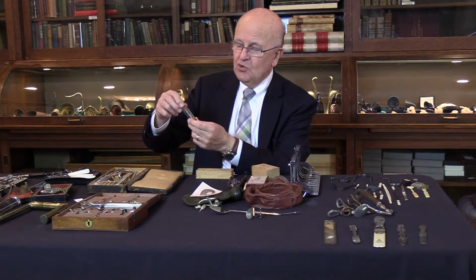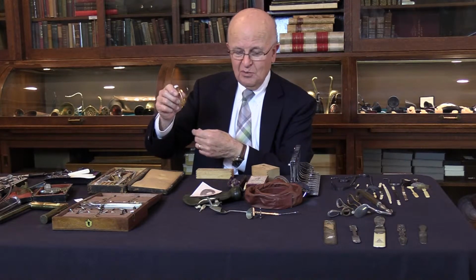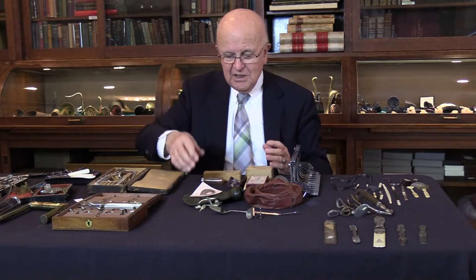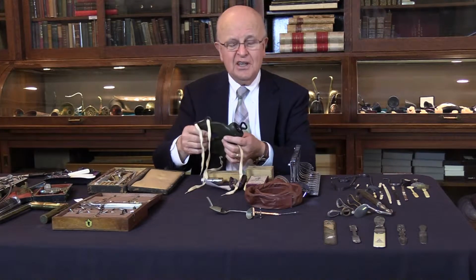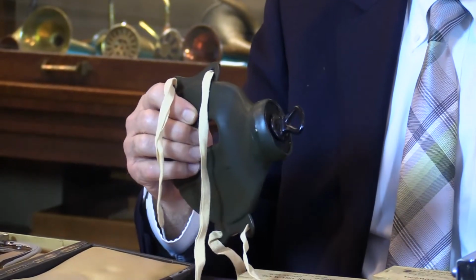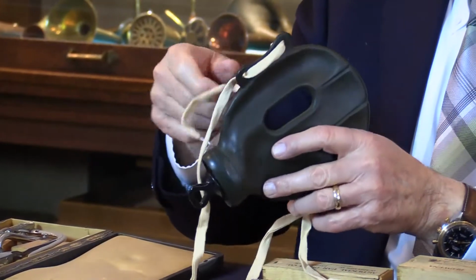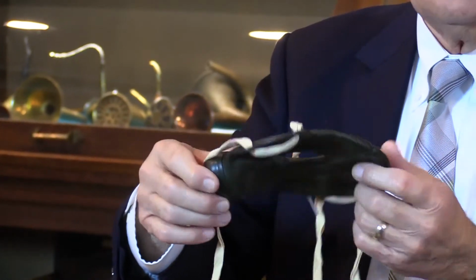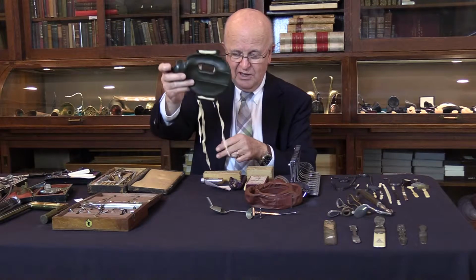I don't think I want to open it, bring it out, because I imagine that it will disintegrate, being that old. There was special equipment for earaches; they had nothing much to do other than some aspirin. So they used this type of rubber container that they put the hot water through, and that hooks around the ear and would help the earache.